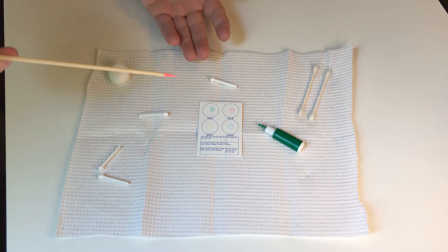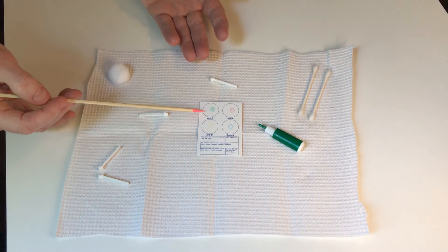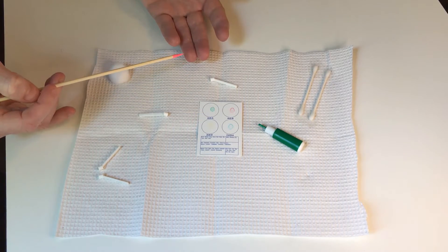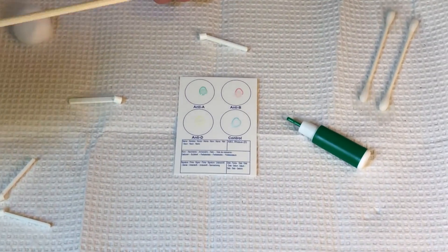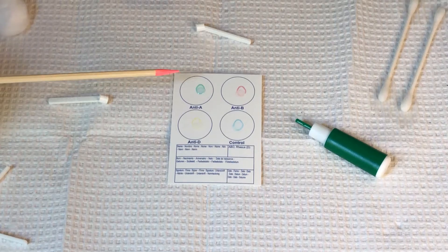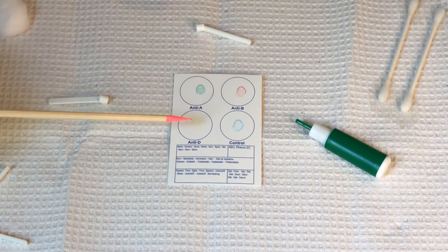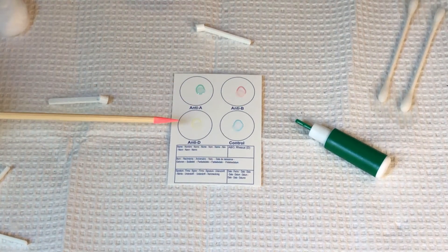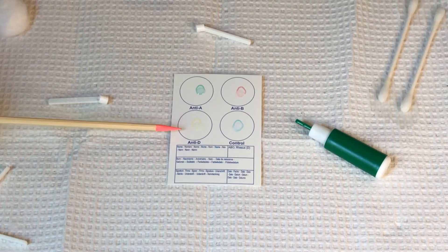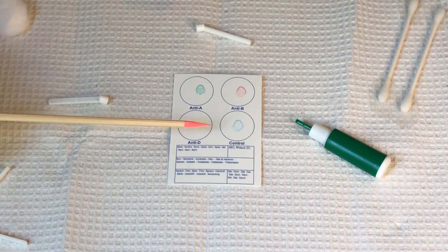This one says anti-A, which means it'll test for the A antigen. If I have A type blood, this one will show a reaction. This one says B. That one says D. D is actually the Rh group, so this tests whether I'm Rh positive or Rh negative. This one's a control. It shouldn't react at all.